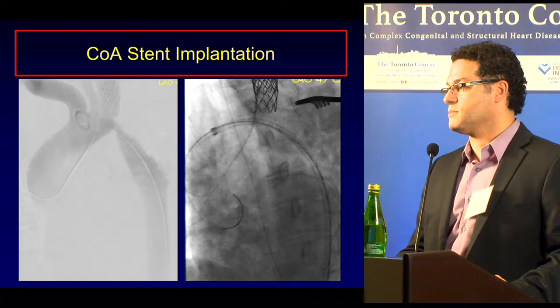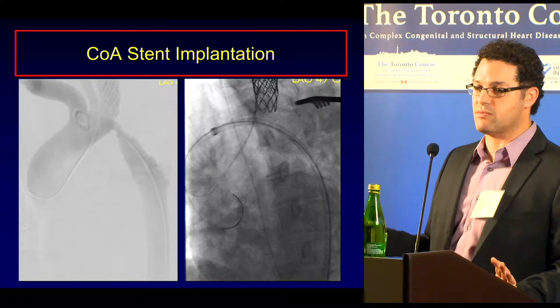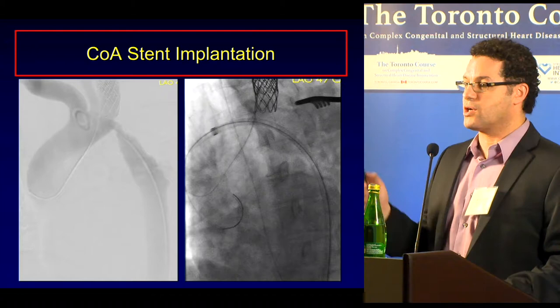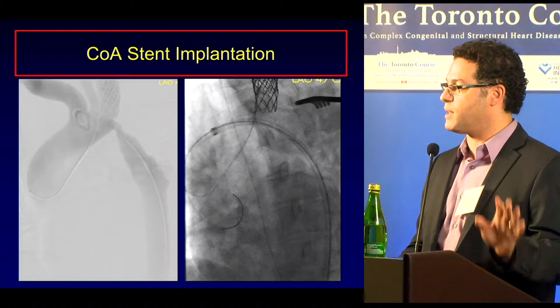So that was our backup plan. So that's one of the keys, is you always have to have a backup or a bailout plan. We weren't sure how this subclavian was going to deal with first. The initial plan is I'm sitting there doing a case with the vascular surgeon scrubbed, the cardiac surgeon pacing at the foot of the table back and forth the entire time because we weren't certain what was going to happen. So our key was first seal the pseudoaneurysm so the hemoptysis stops, the bleeding stops, and the patient stabilizes. From there, we then had the opportunity to see what else there was.